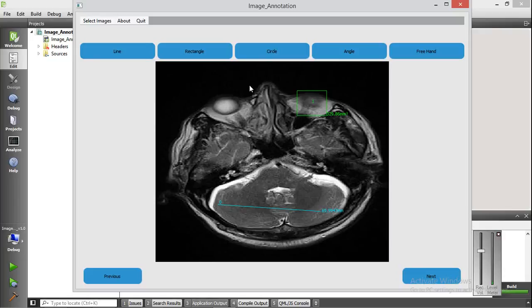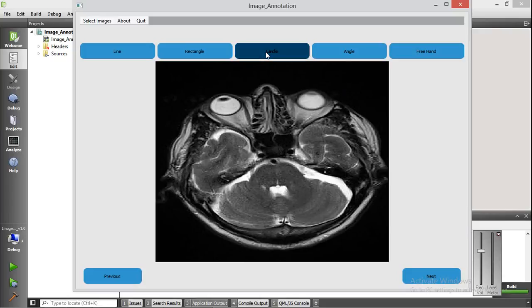To annotate with a circle, you select the circle option and draw a circle on the image. You can also resize the circle annotation. The area under the circle is calculated. Let me go to the next image and annotate with a circle — adding one more circle. The area is calculated for both circle annotations.